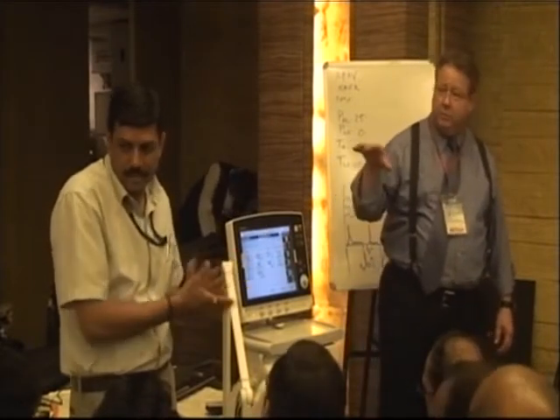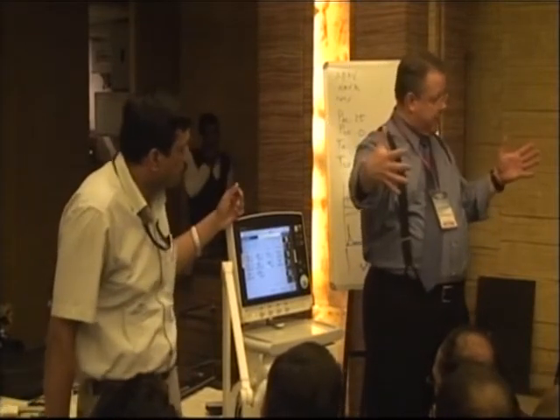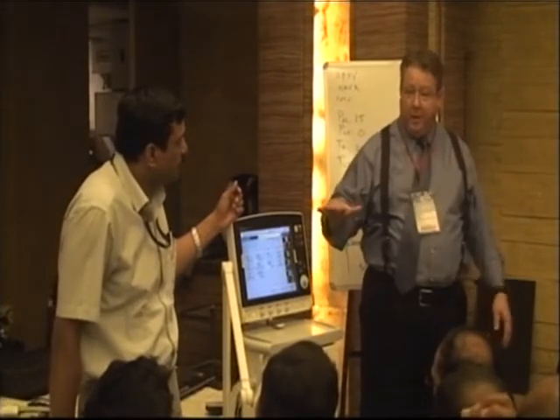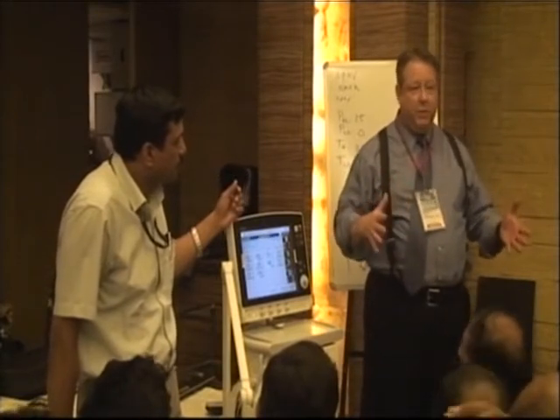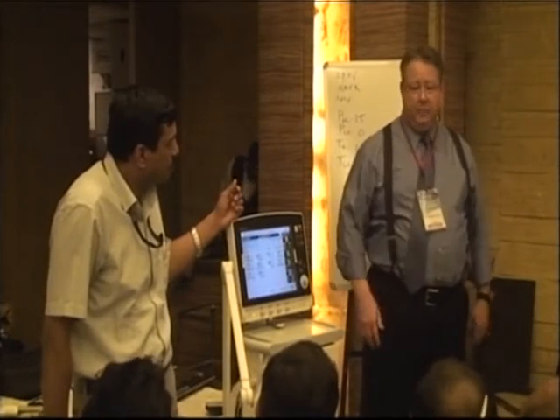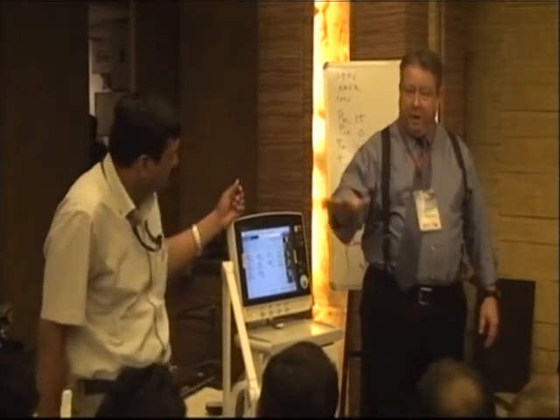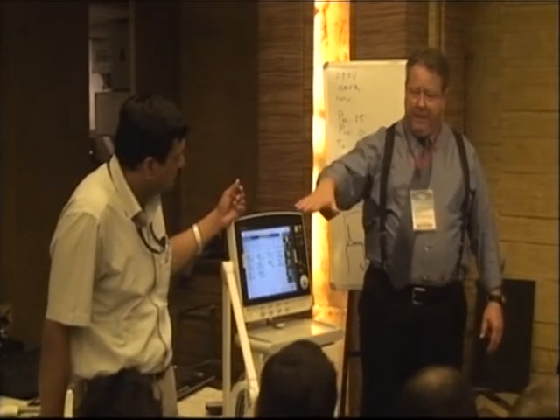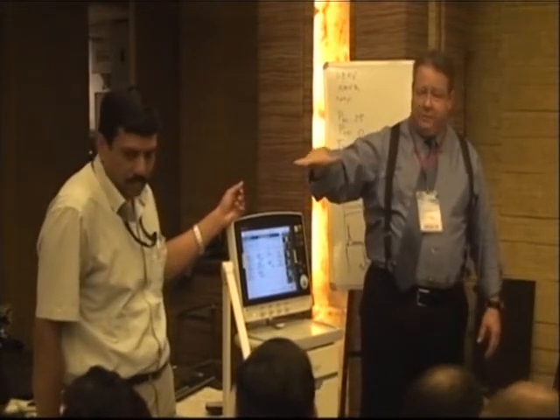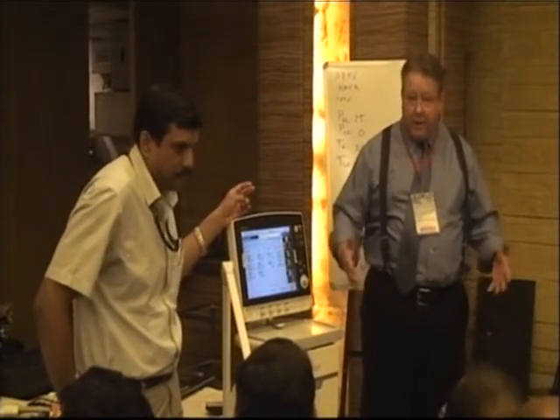Weaning from this mode: the way we typically wean is to drop our P high and lengthen out our I times. So we're having fewer cycles and fewer releases, but they're breathing more spontaneously across a more normal pressure. Then as the pressure comes down to maybe a 10 or 12 range, you can extubate them to BiPAP from there if they're breathing spontaneously. You wouldn't necessarily convert back to mechanical ventilation. You just maintain the pressure but drop it steadily. If they started at a P high of maybe 25 or 30, you steadily go down in increments of 4 to 6, down to 14, 15, and then maybe down to 10. Then you'll probably extubate them from that if they're waking up and ventilating.